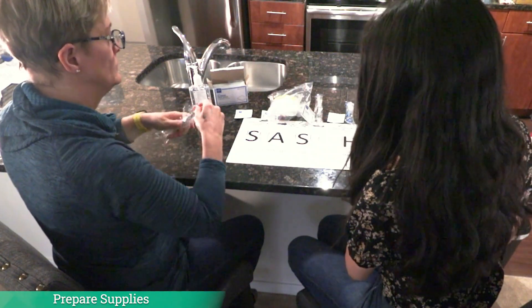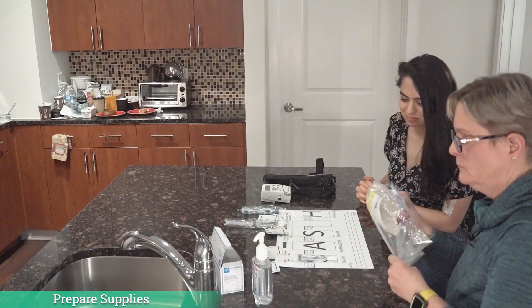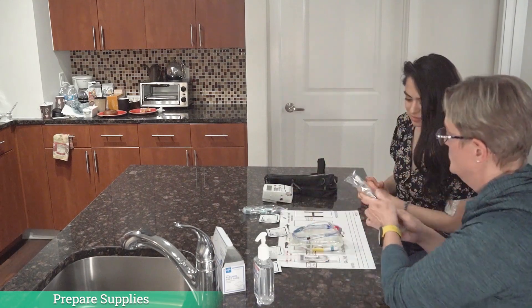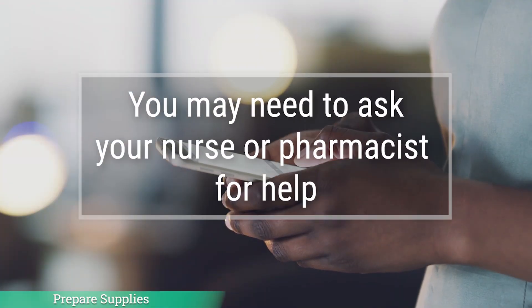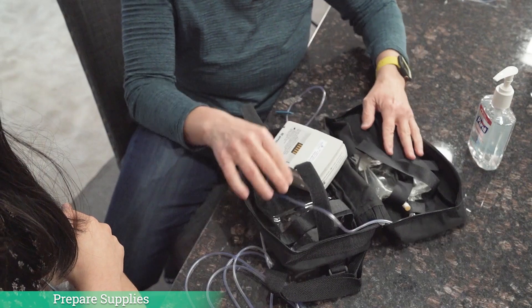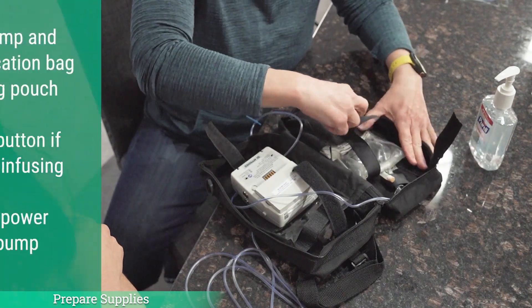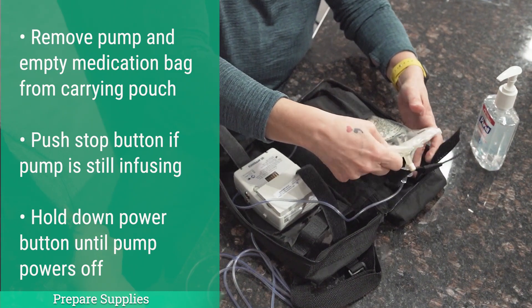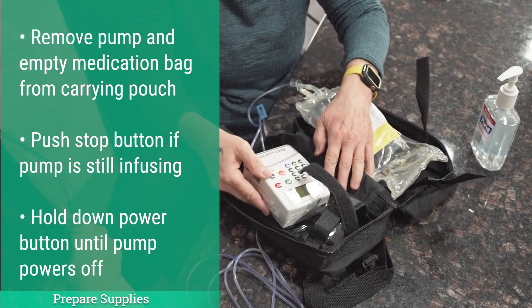You may notice that your medication may come with the tubing already attached to the medication bag. If this is the case, you may simply need to remove the medication and attached tubing from the plastic bag and place it back over the A on the sash mat, which is for administer or antibiotic. Now your sash mat is all set. Depending on the pump you have at home, you may need to ask your nurse or pharmacist how to use your pump. We will be using the bodyguard pump in this demonstration. If you already have a bodyguard pump and a medication that is ready for a bag change, remove your pump and the empty medication bag from your carrying pouch. Place the pump on your clean work surface. Push the stop button if the pump is still infusing, and hold the power button down until the pump powers off.